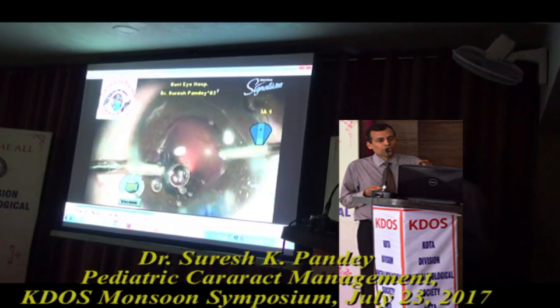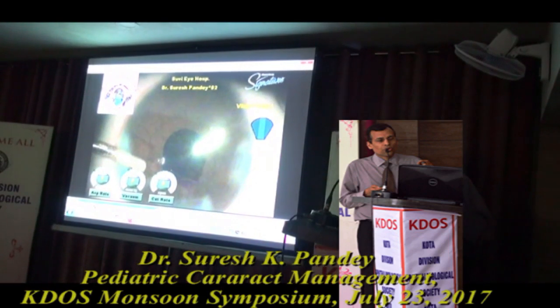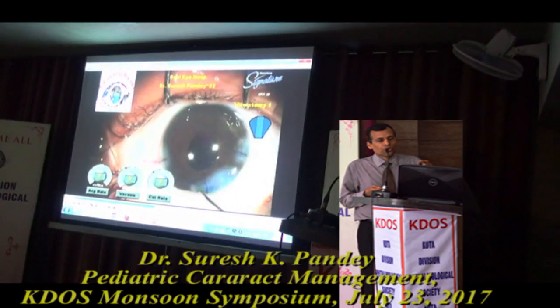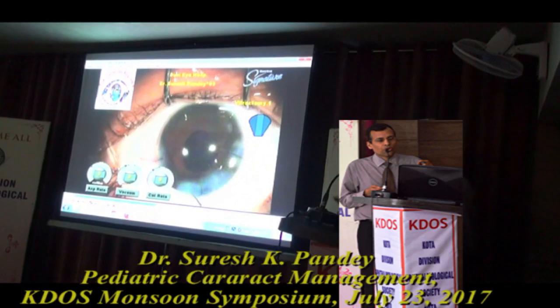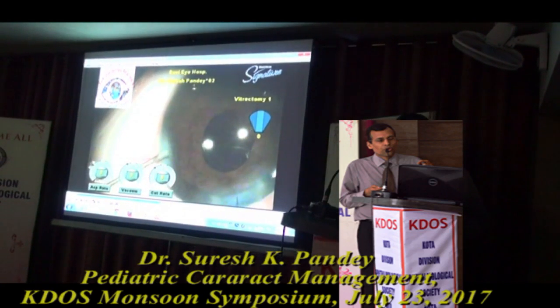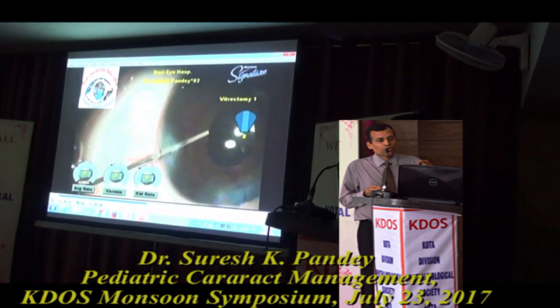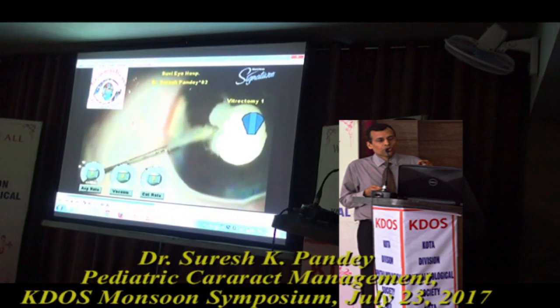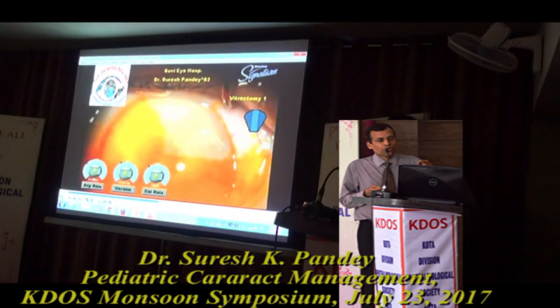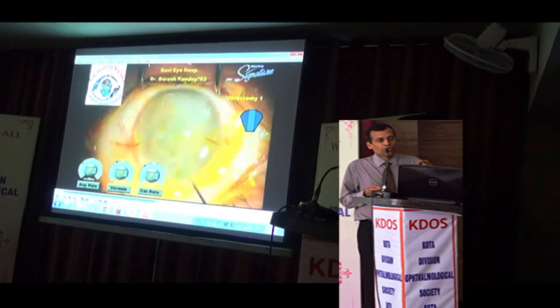With the help of the preservative-free triamcinolone injection, we can see if there is any vitreous strand in the anterior chamber or not. Secondly, it provides a very good anti-inflammatory effect postoperatively. So this is one of the cases of pediatric cataract, and in our practice we usually use intracameral moxifloxacin or Vigamox injection. At the end of the surgery, I once again cross-check if there is any residual vitreous strand in the anterior chamber by washing with the triamcinolone injection.